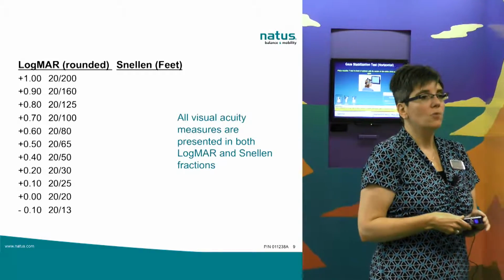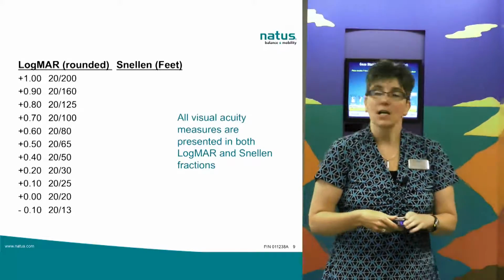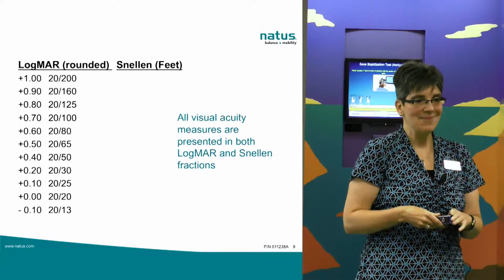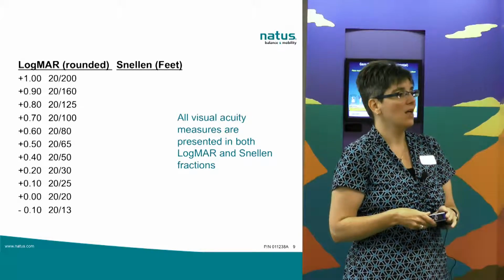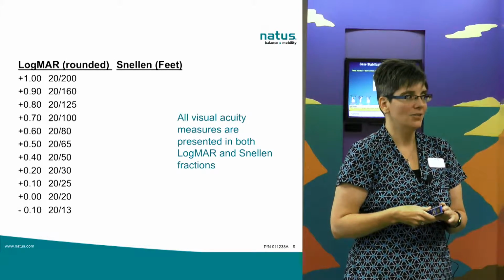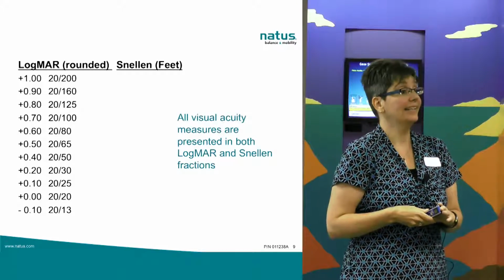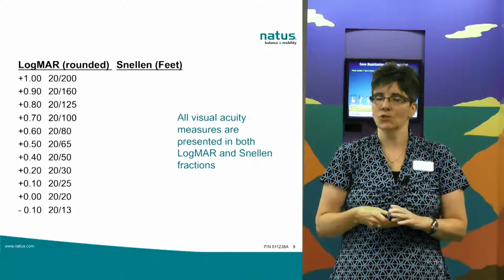We report the results in both Snellen and logMAR. There was a question on what's the largest optotype that the computer will show, and it's 1.0 logMAR adjusted for the patient distance. So how many lines above 20/20 is 1.0 logMAR? 10. 10 lines bigger than 20/20.